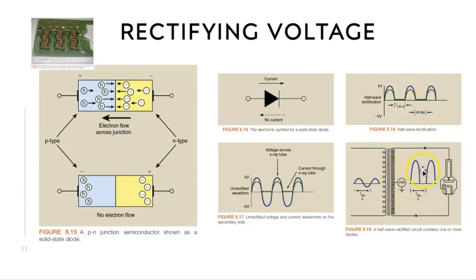Now, what this can create is a gap. What that would mean in the X-ray tube is that you're getting X-rays, getting X-rays, and then all of a sudden nothing happens. Getting X-rays, nothing happens. Think of these waves as a reason for electrons to move and X-rays to be produced. We're creating that potential here.